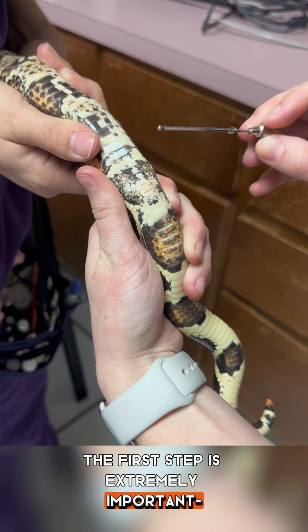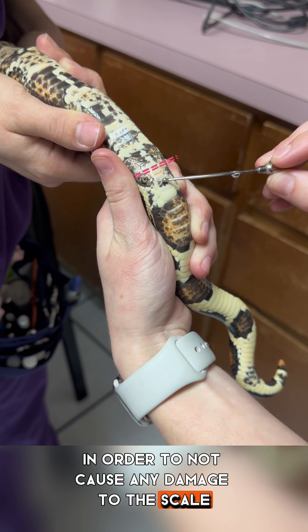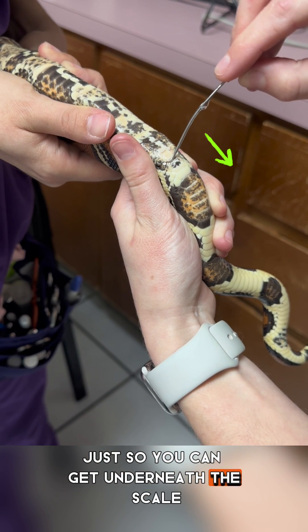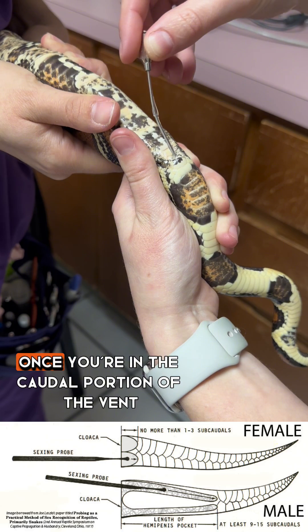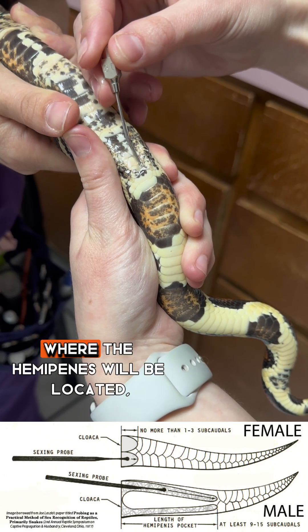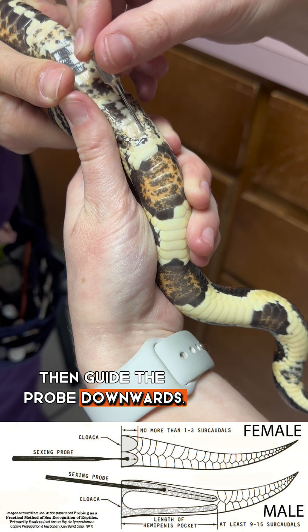The first step is extremely important. In order to not cause any damage to the scale laying over the vent, angle your probe going up just so you can get underneath the scale and then flip it downwards. Once you're in the caudal portion of the vent, guide your probe to either the right or left side where the hemipenes will be located. Then guide the probe downwards.